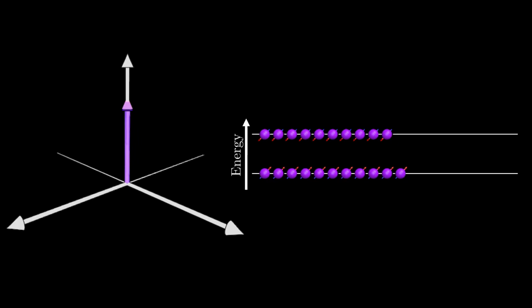The difference is that the energy separation of the two states is proportional to the external magnetic field strength, B0, as opposed to just atomic structure. So, we'll do a proper video of NMR quantum mechanics later, but for now we'll stick with the tried and true classical description. So from now on, I will use a single arrow vector to describe the nuclear magnetization vector of our spins within a particular space.